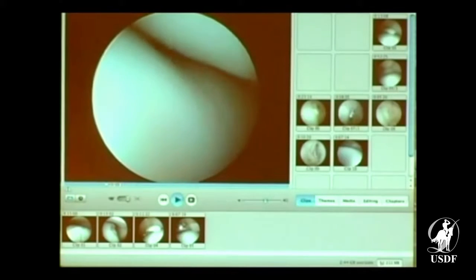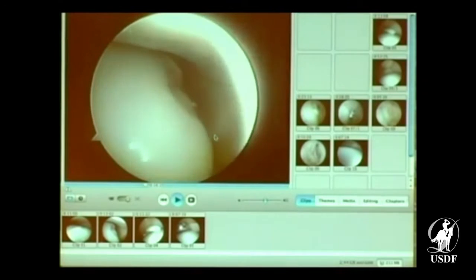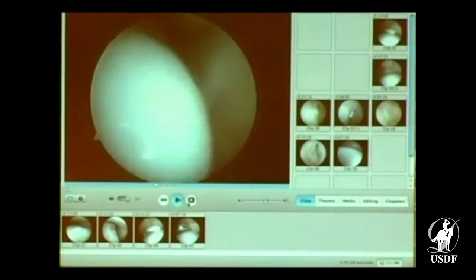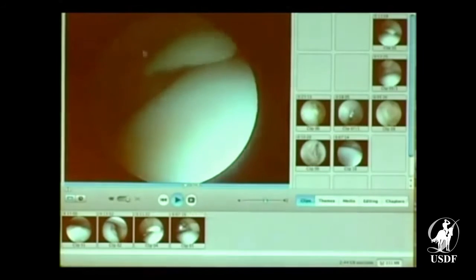So here's the patella up, there's the groove that it slides in, but here's the area where they commonly get OCD. And it's not normal, so I'm going to debride it here and take that abnormal cartilage off, but it's way over on the side, and so it's not going to affect this horse's performance. But I still couldn't figure out about this fragment. And so when I'm looking around the joint here, doing the rest of my exploratory after debriding that area, oops, there's a little, whoa, what's that doing there? Okay, so there's the fragment, and that's rare.